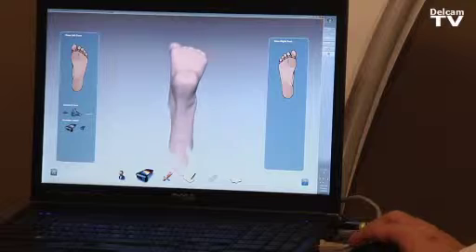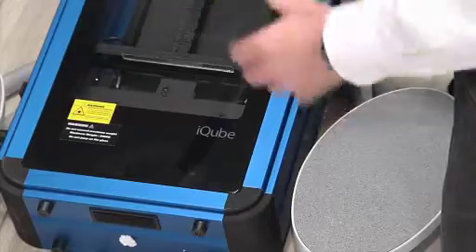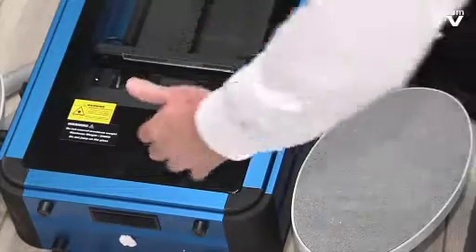It's clearly possible to see the calcaneal angle and other features. From semi-weight bearing, it's very easy to move the iCube scanner to a full weight bearing position.